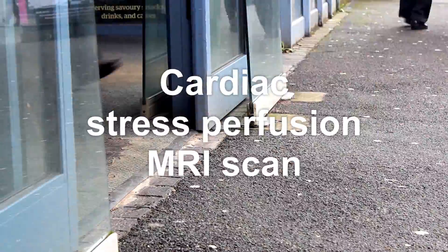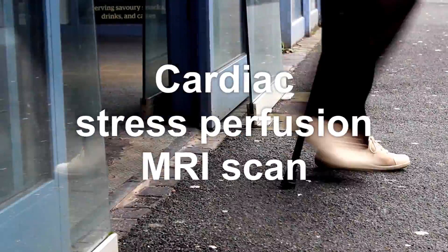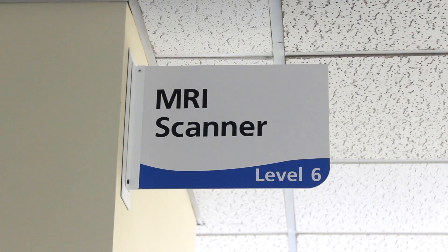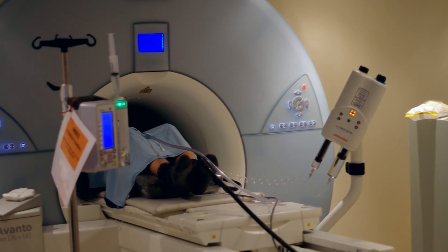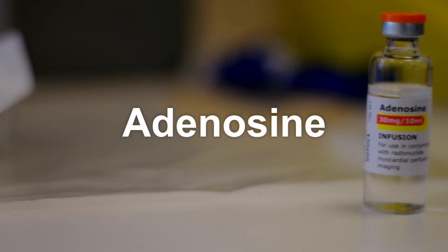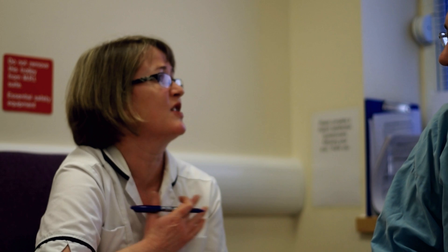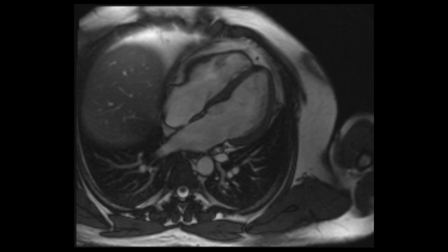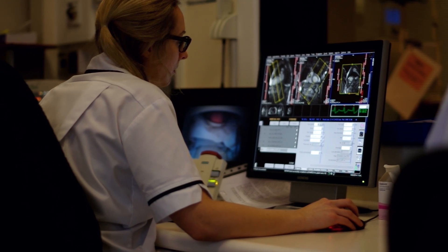You're going to have a cardiac stress perfusion MRI scan. This film will explain what the scan will involve and allow you to prepare for the test. An MRI is a magnet scanner which takes really detailed pictures of the heart muscle without using x-rays. Stress perfusion means giving you a medicine called adenosine that makes the heart work harder, as if you were exercising, and looking at the effect on blood flow in the heart muscle.